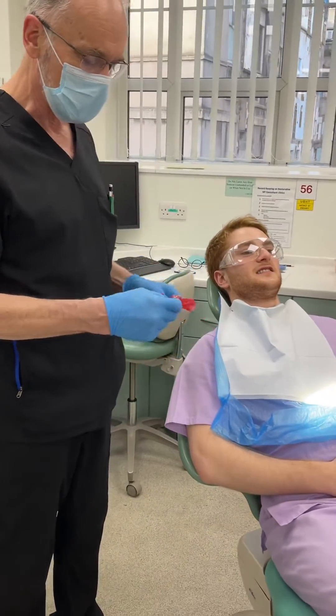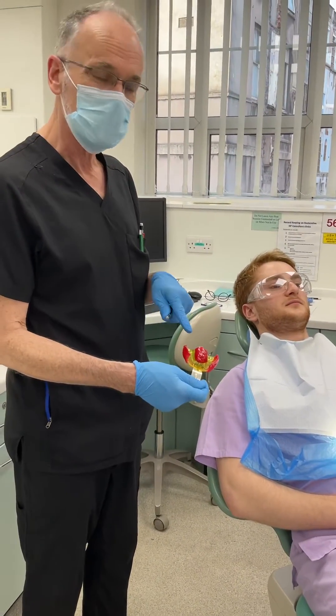So now we're going to take an impression which doesn't involve the labial aspect of these teeth. That's the whole point of this.